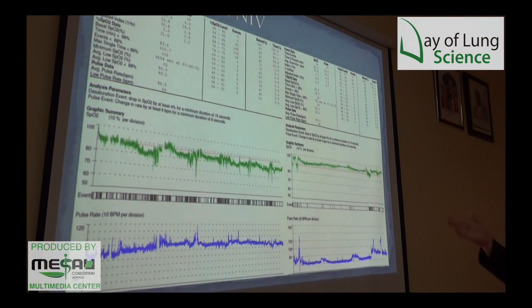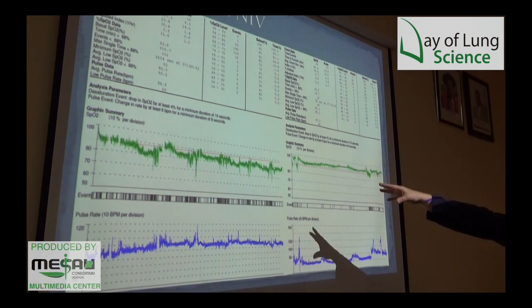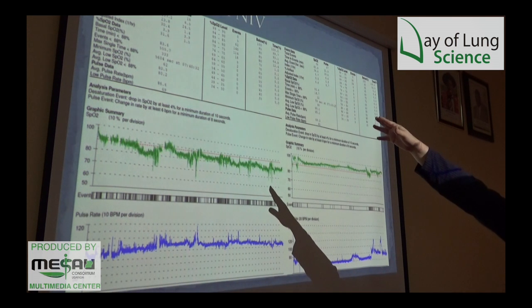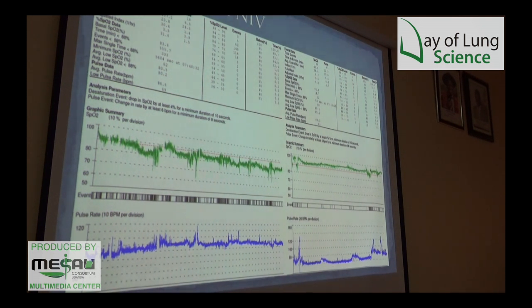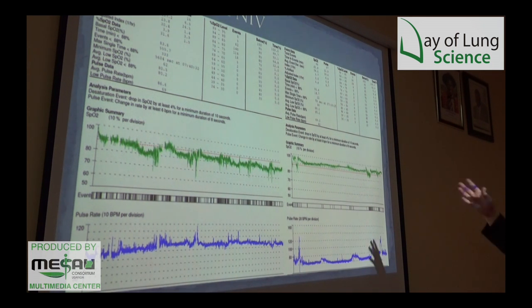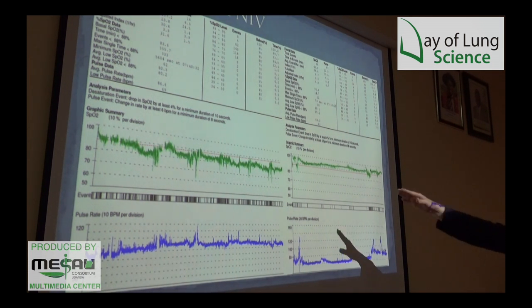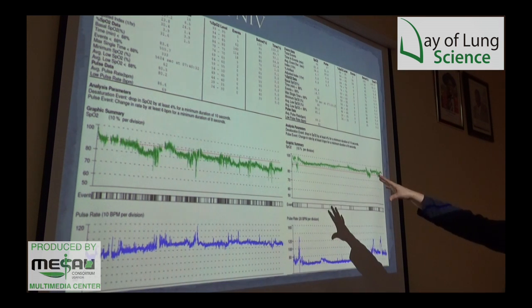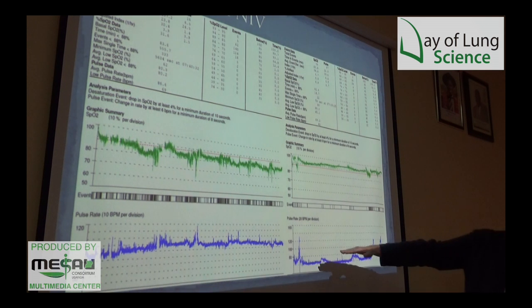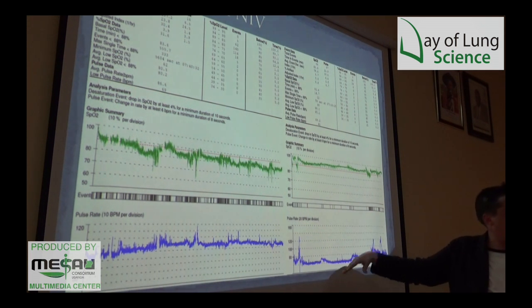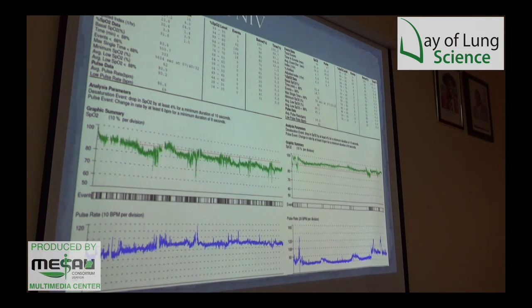Here's a trace from pre and post non-invasive ventilation. Initially the patient was completely under-oxygenating with 32 events per hour — severe sleep apnea with hypoventilation. But once treatment was initiated and the test repeated: almost normal, 6 events per hour. It's effective treatment, as you can also see the pulse has reduced, meaning far less cardiovascular stress.